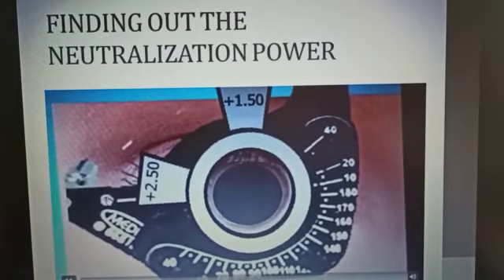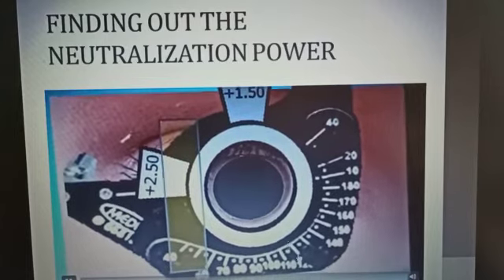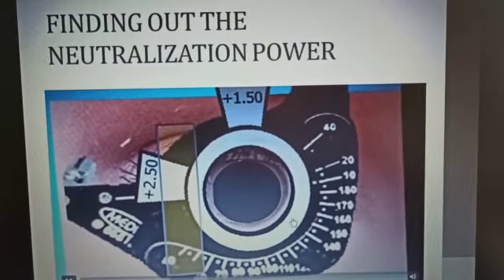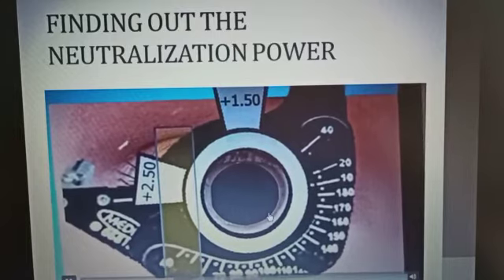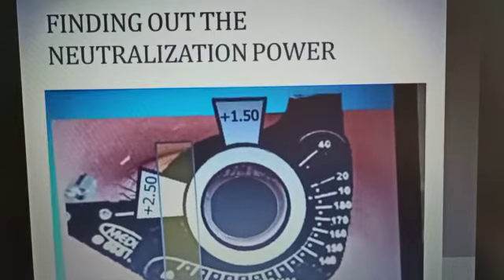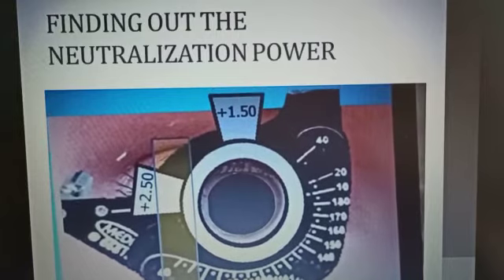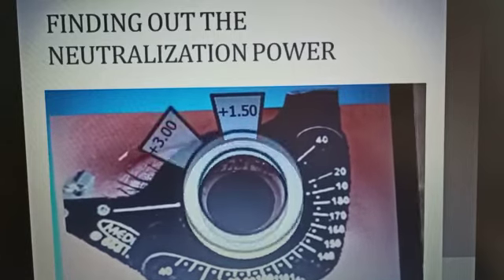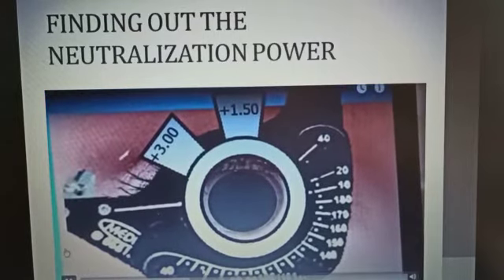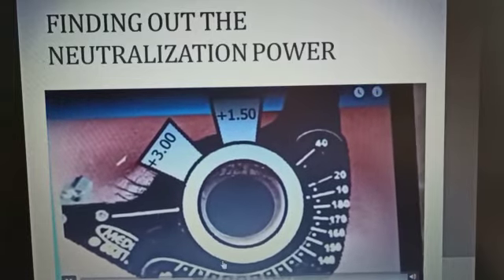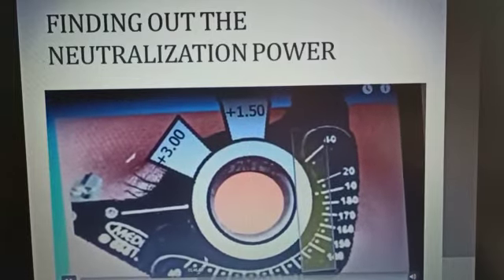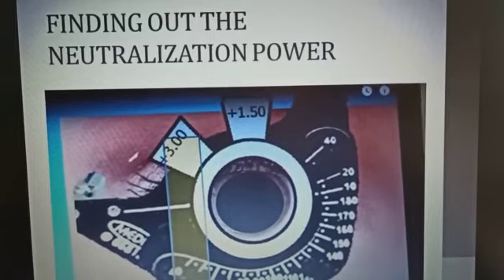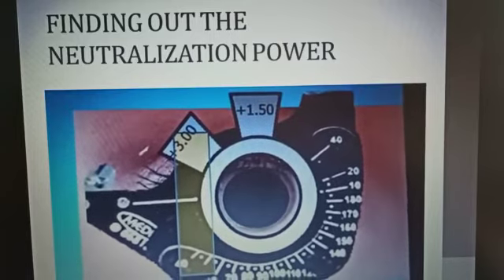Now let's proceed with plus 2.5. Here you can see the pupil reflex is almost filled, but not totally filled. So we haven't reached our neutralization point yet. We will proceed with a higher plus power. Now let's try with plus 3. Now let's see the reflex again. You can see the whole pupil is filled. We know that we have neutralized the vertical meridian with plus 3 spherical power.